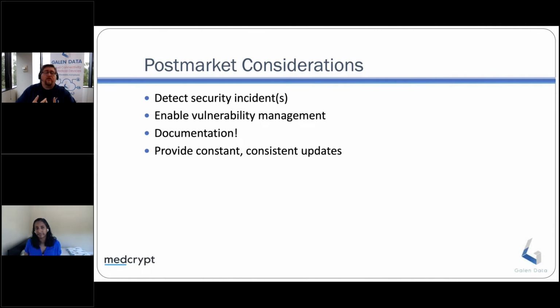I think the FDA has been maybe not as proactive as they needed to be, but they've definitely been pushing that much harder, much sooner. As far back as 2010, I can remember working at Cyberonics, now LivaNova. They were very concerned with communication protocols and encryption around that. There was a lot of talk about how a cardiac pacemaker was just open to the world and anybody could reverse engineer the communication protocol very easily and walk by and kill somebody. I don't know that actually happened, but I think it was a wake up for the industry.